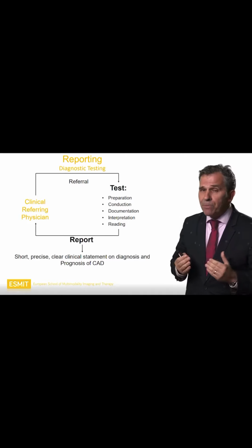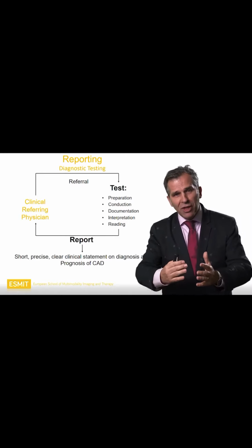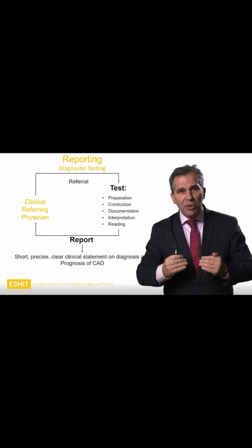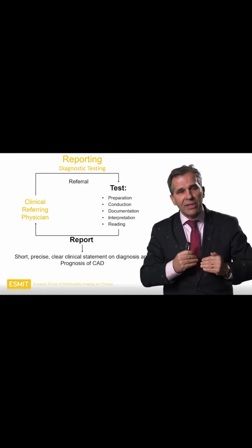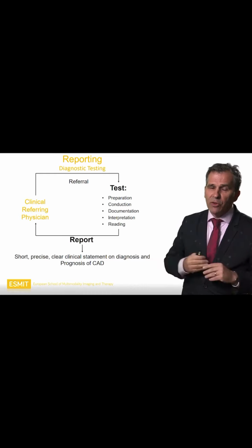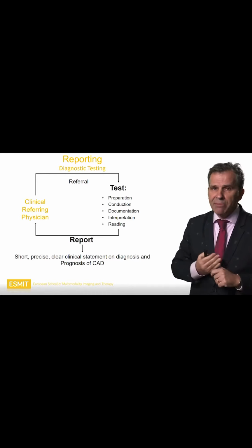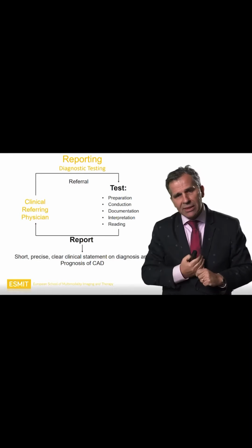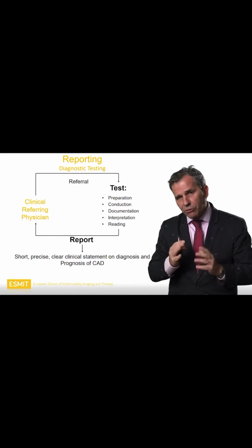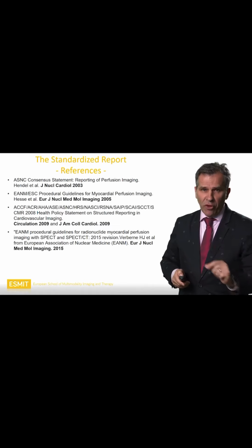And finally, in some cases, it's possible to push the clinician to another strategy, to say, now we need the cath lab, you need a more aggressive investigation by angiography, and maybe the patient needs PCI, or maybe stenting, or maybe CABG if the ischemic pattern is very high. So this is, to my mind, the very important report to do for the clinician. Thank you for your attention.